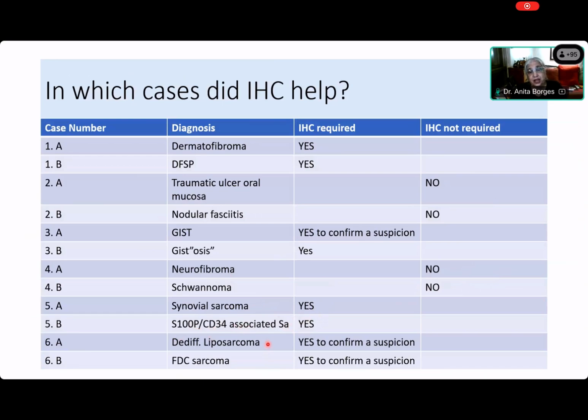And of course, this we would not be able to diagnose unless we had these two. Yes. Dedifferentiated liposarcoma, often you've got a large retroperitoneal tumor. Look carefully for lipoblasts. And if you see them, if you want to do an MDM2 to confirm it, fine. But there's not much that one can do about a dedifferentiated liposarcoma. So if you call it just a high-grade sarcoma, you haven't done anything terrible.